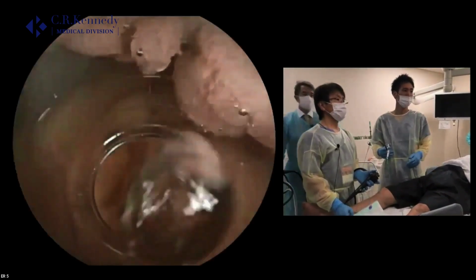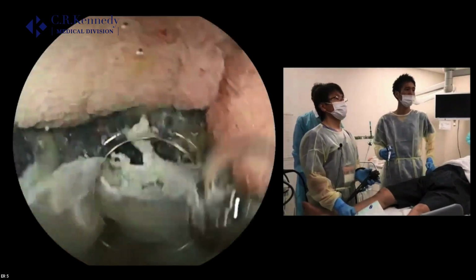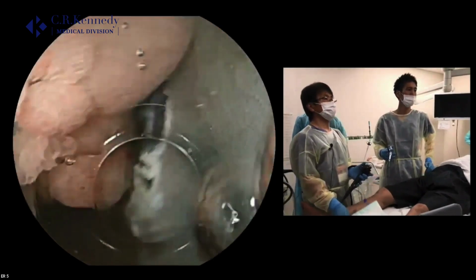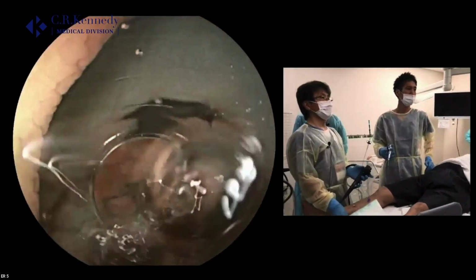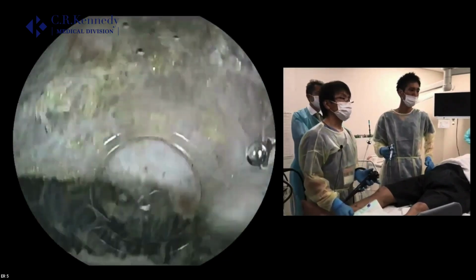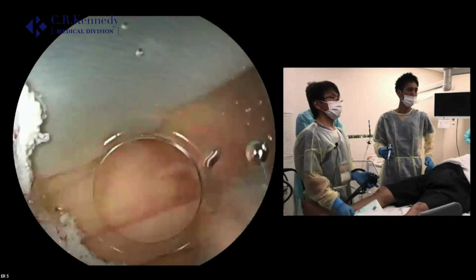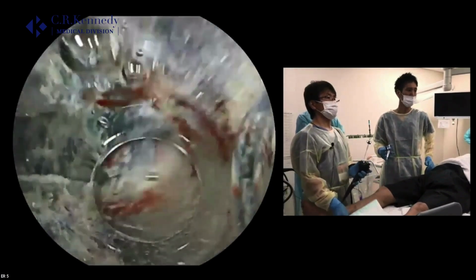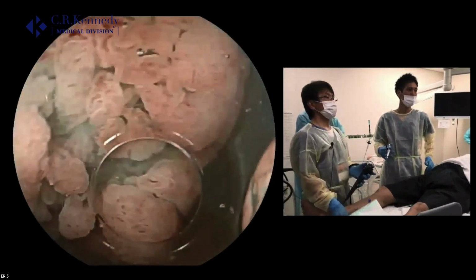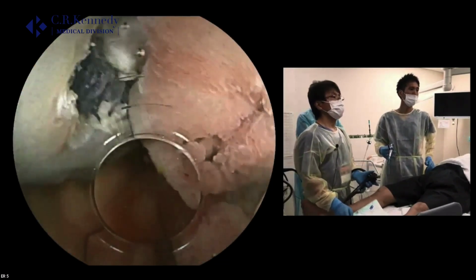And now I completed the pocket. So I made the pocket like this. This is the muscle, and this is the other side of the pocket. So only both sides remain now.